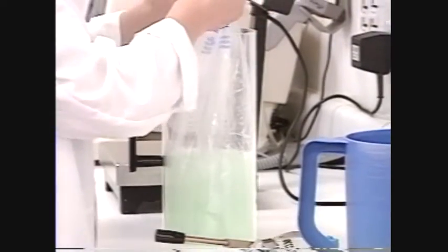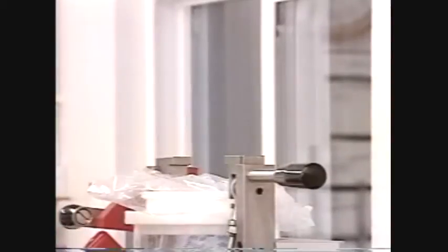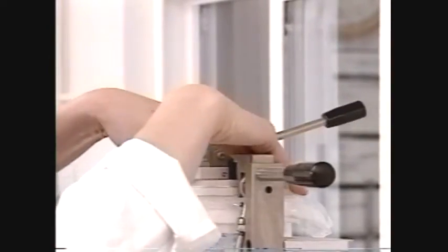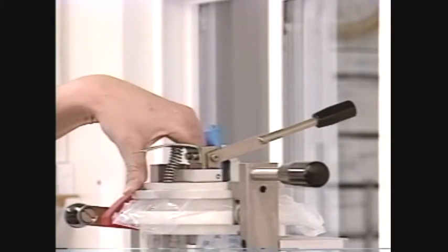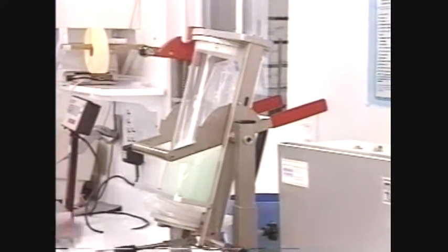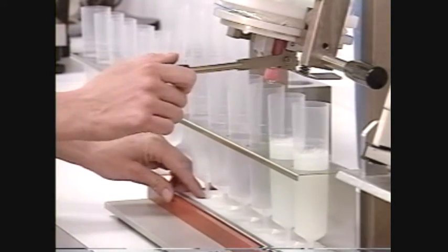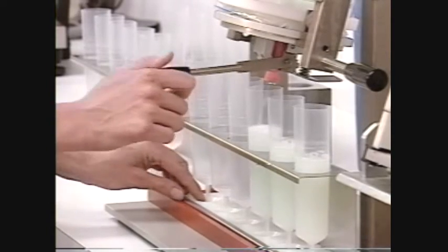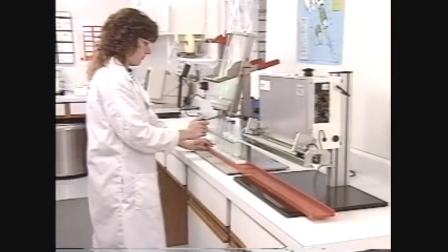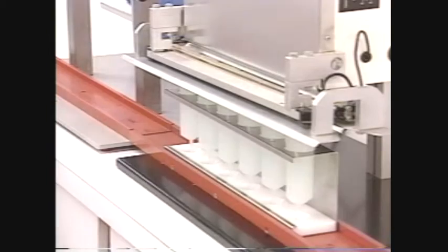In larger labs, a commercial dispensing unit is used to fill semen tubes. Place the plastic bag of extended semen into the dispensing unit and a nozzle in the dispensing head. Place the head on the dispensing unit, being careful to first bring the bag through the plastic ring and fold it over the edges. Clamp the head into place and rotate the dispensing unit to mix the semen and prepare for filling the tubes. Place a rack of tubes on the guide and position the first tube directly under the nozzle. Fill each tube to the desired level and slide the rack into the sealing unit. This unit will seal 6 tubes in about 15 seconds.